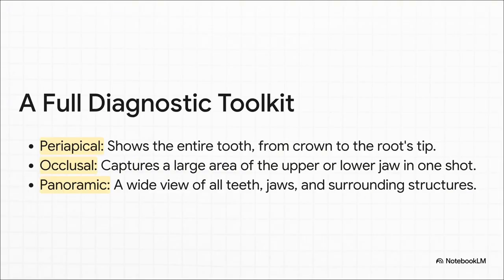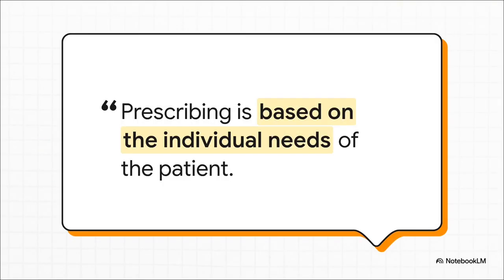And this, right here, is probably the most important takeaway. There is no one-size-fits-all approach when it comes to dental X-rays. It's not a routine. Your dentist uses their professional judgment to prescribe the exact images you need, based on your unique health history. It's completely personalized care.